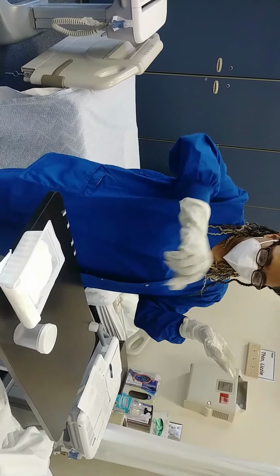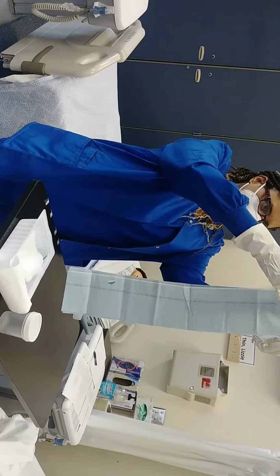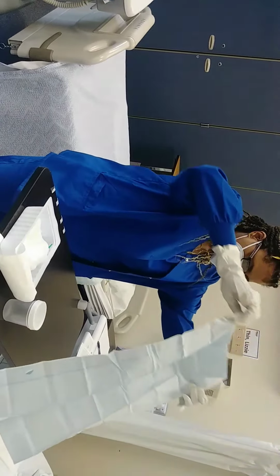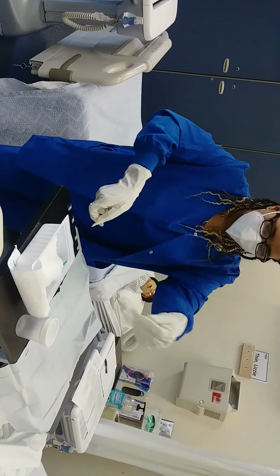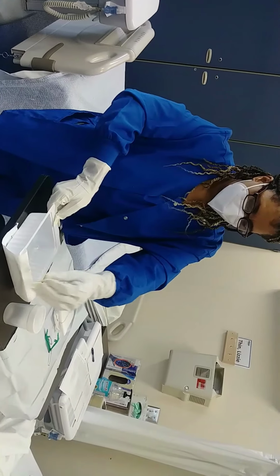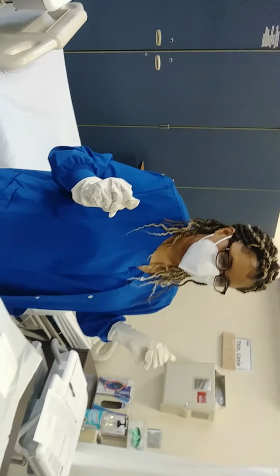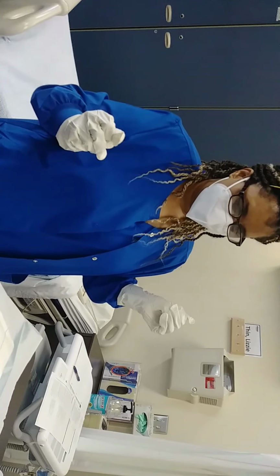Okay, now that I have sterile gloves on, I can reach inside of this open sterile field, and I want to bring out my drape, just touching the edges. Okay, so I do have the tape underneath that. And then I'm going to reach in and bring my remaining materials. I'm going to ask my assistant to please consider pouring sterile saline into the sterile field, lipping it and then pouring in the remaining amount.